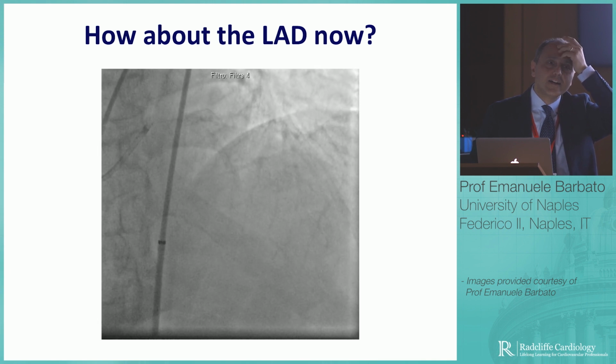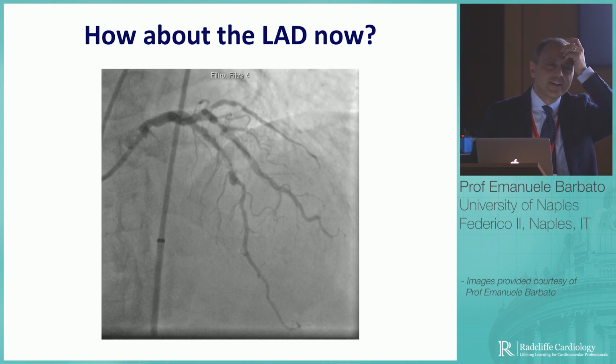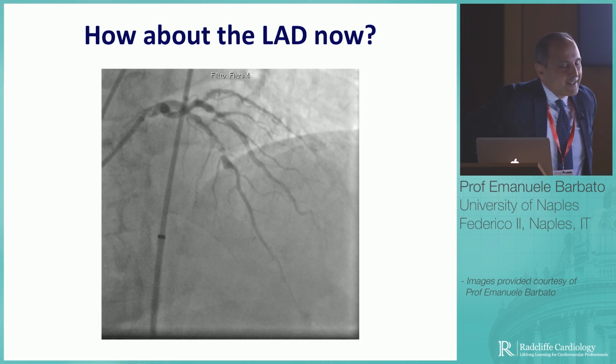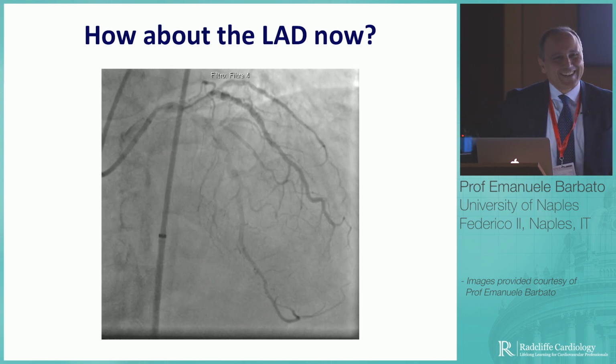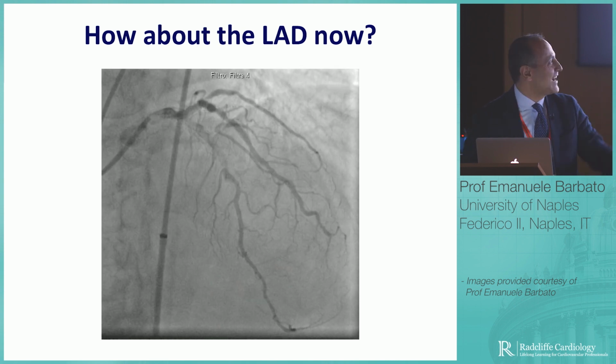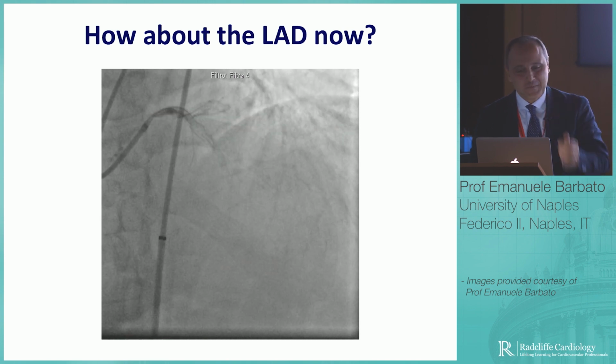What do you mean it's open? You have a certain amount of... Yeah. Are you confident that it will cross? No. I would not do shockwave in this case.